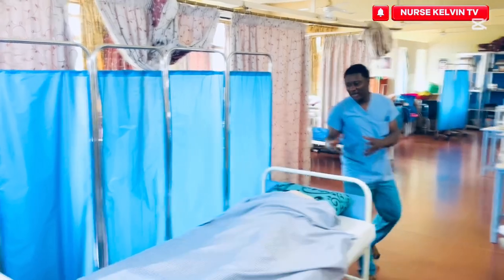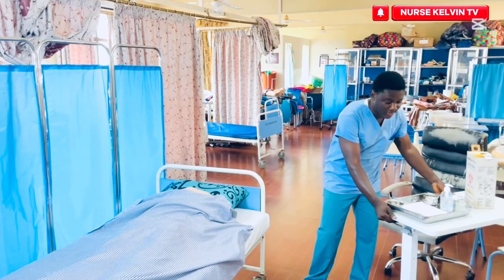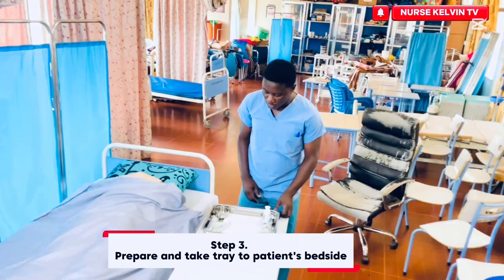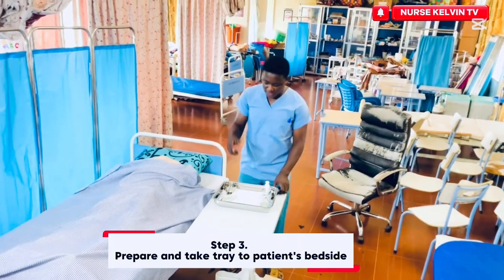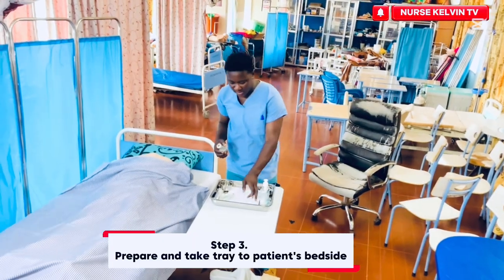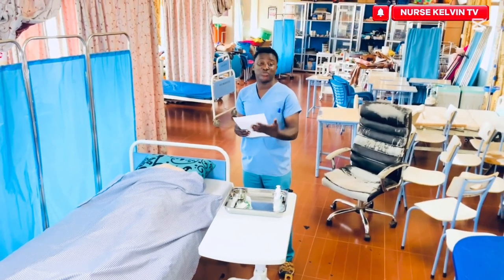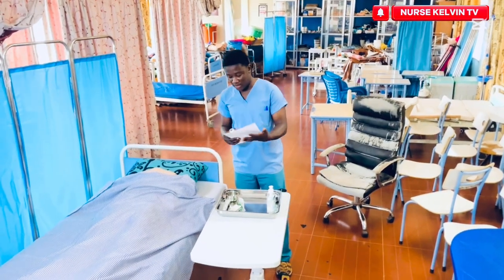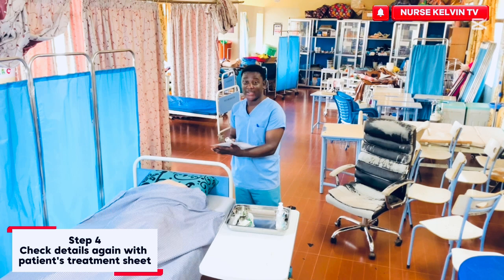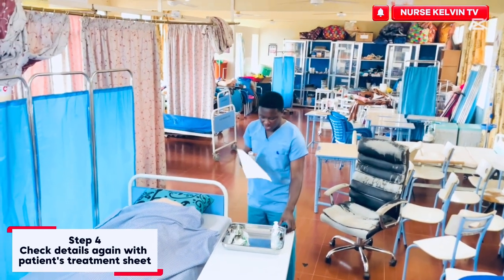So after we are done providing privacy for the patient, we need to bring our items closer. So these are our items. First we need to do the checks with the medication. So we need to take the medication, then do the checking with the treatment sheet to find out indeed the medication that you are supposed to give to the patient. So you need to check. Then you check your time.